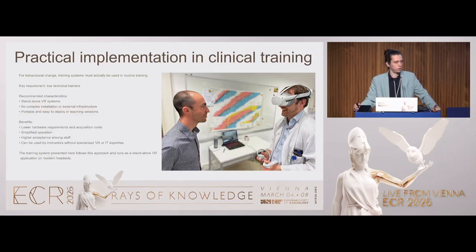And one side note with a little bit more text, you can read that at home possibly, just outlining one important thing that we learned during the project, and anyone who wants to try something like that should keep in mind. The best simulation is useless if people can't use it in everyday life. So it has to find its way into everyday training, and by that I mean it has to be easy to use. In the beginning, we still had to connect the VR headset to a strong gaming PC or laptop. We had to arrange external trackers and all of that.